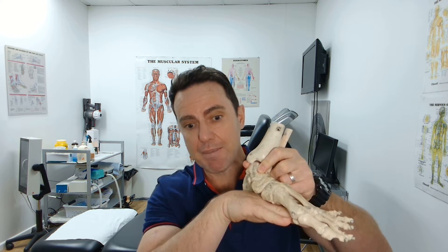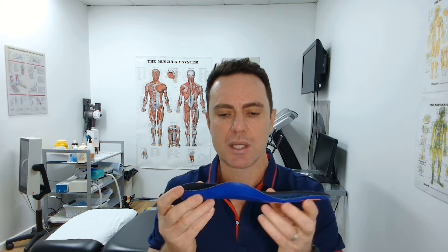If you've already got plantar fat pad atrophy, we do the same thing — we just try and replace the work that was being done by the plantar fat pad in your foot, and we do it with the orthotic insole.